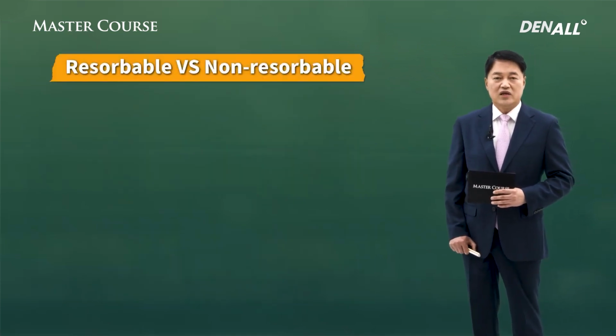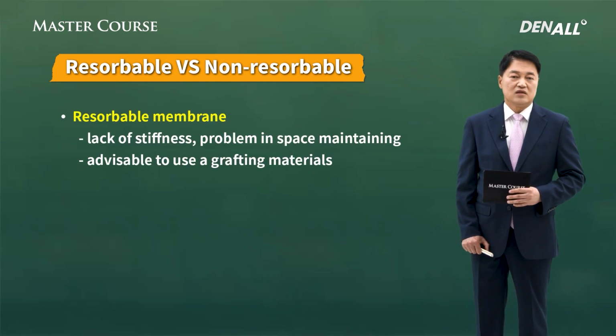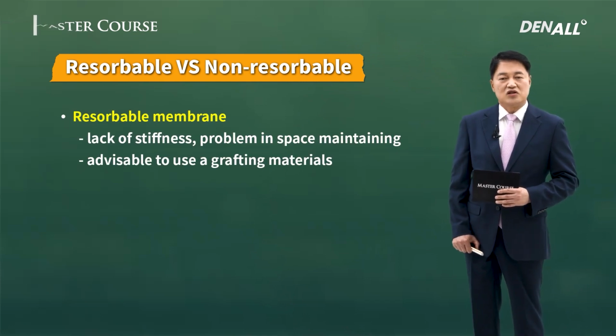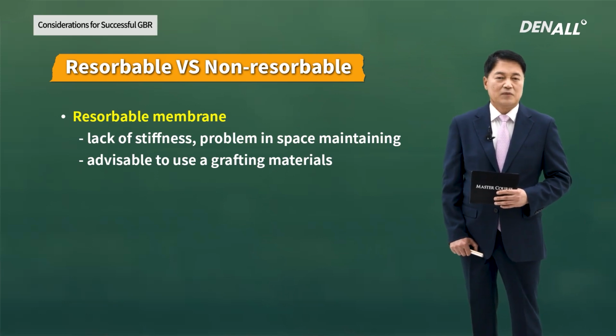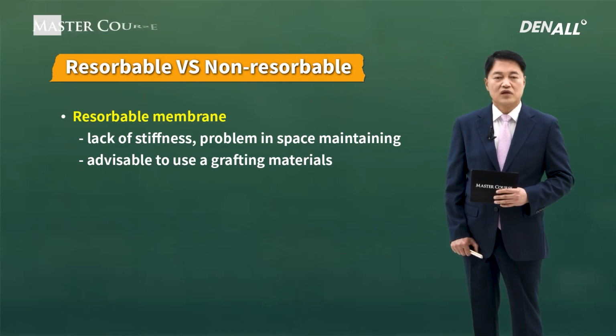Membrane can be divided into resorbable and non-resorbable membrane. Let's compare the two. Resorbable membrane lacks stiffness and has a problem in space maintaining. Therefore, graft materials need to be used sufficiently.